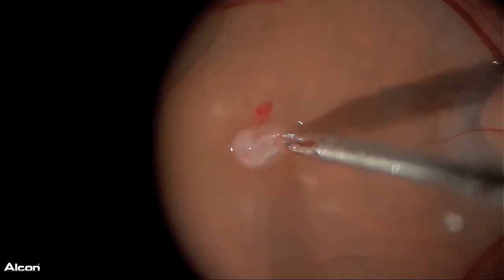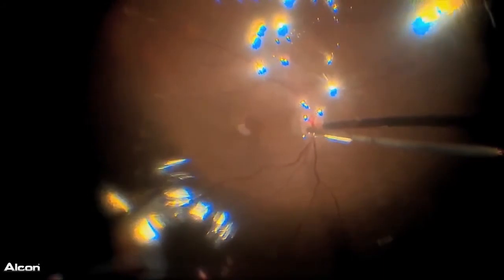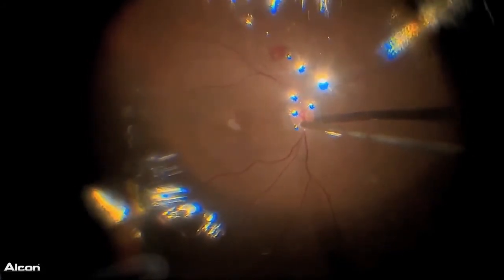So I decided to perform the ART surgical procedure, with a small piece of retina covering the large macular hole. I routinely use chandelier illumination with the 3D system because more light allows us to have a better resolution compared with no chandelier illumination.